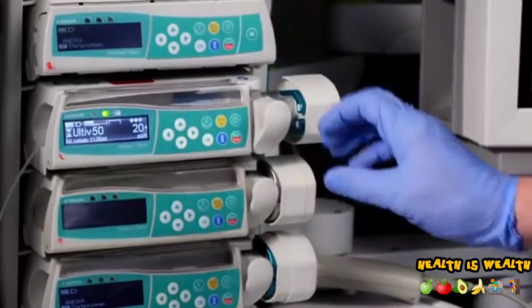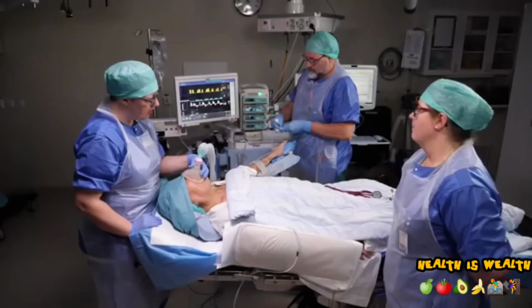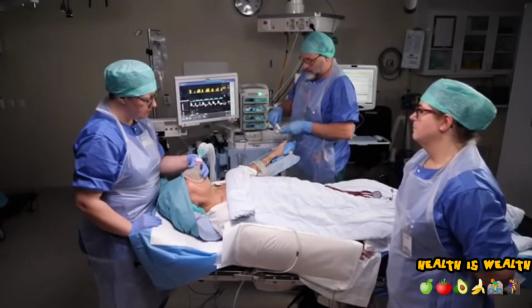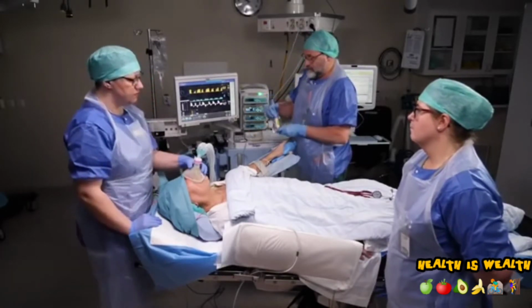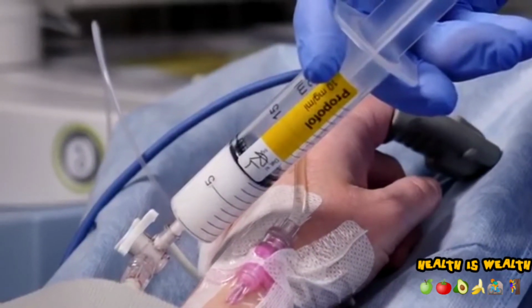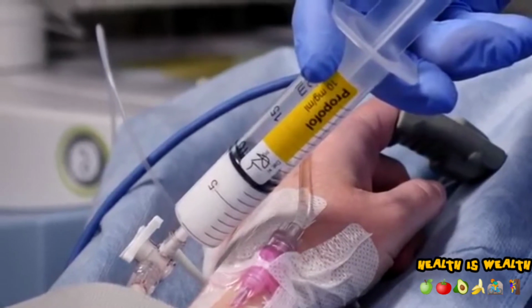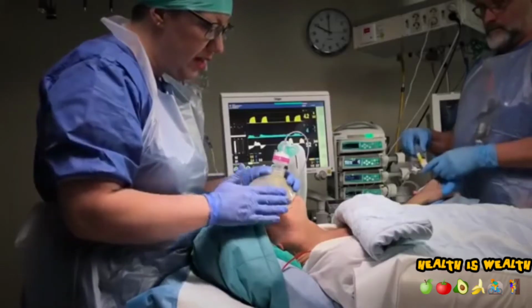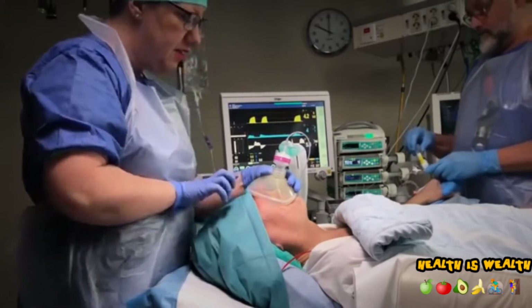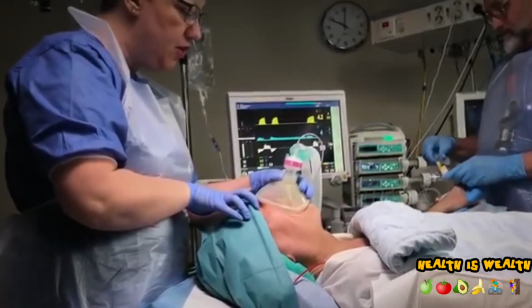Administer the analgesic and await the onset. Laryngoscopy is very painful and requires drugs to alleviate sympathetic response and airway reflexes. Next, administer the hypnotic. The patient gradually loses consciousness, airway muscle tone and respiratory drive. From this point on, the patient's breathing is your responsibility.